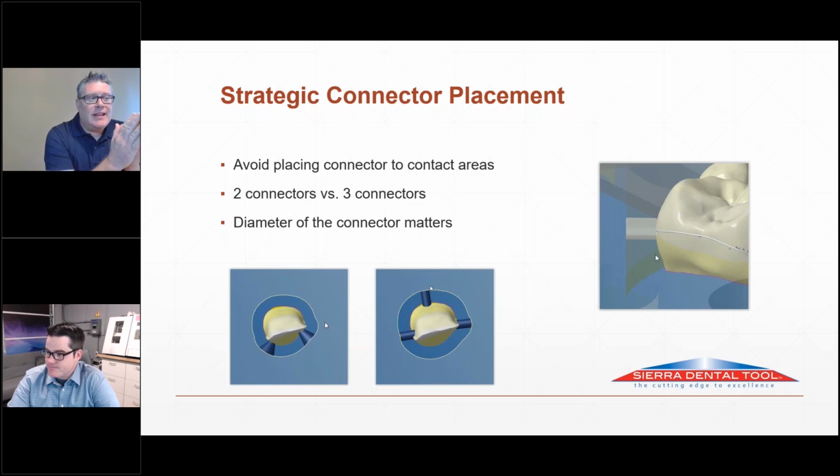Now, the only thing that you need to adjust is it needs to be a 2.5 millimeter in diameter for zirconia. PMMA, you can get down to 2. Wax, I'd still keep it at 2.5 because the wax has an oscillation when it's milling that it vibrates.